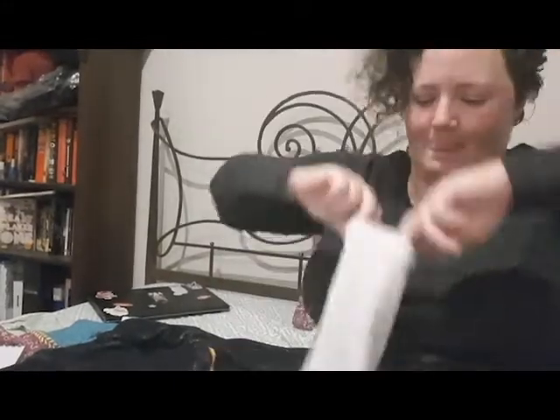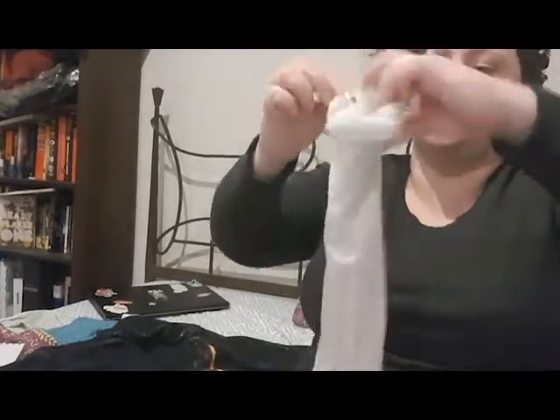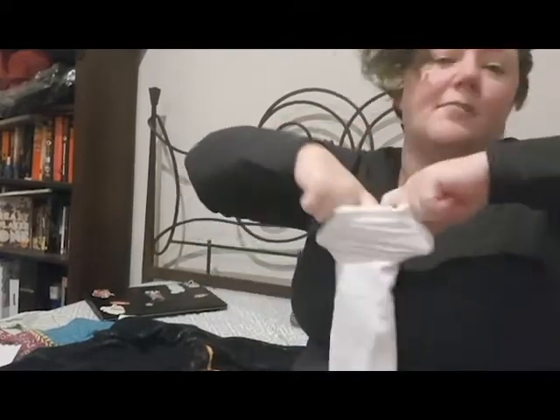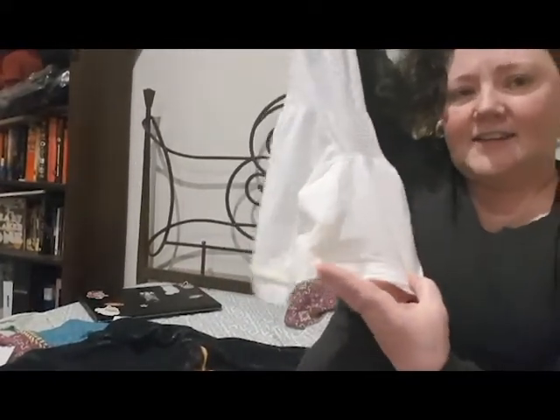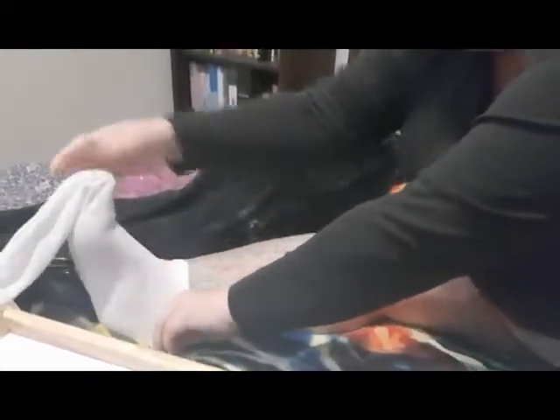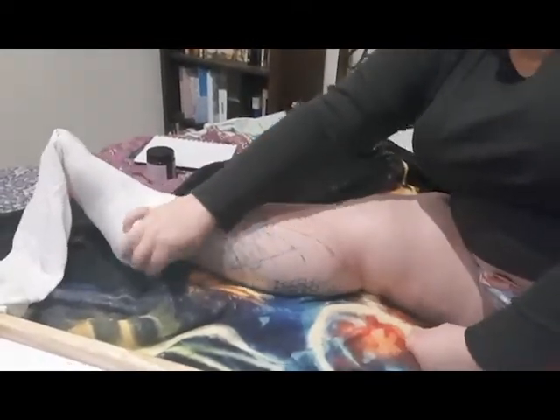Okay, so I can feel for the extra loose lumpy bumpy bit for the ankle, for the heel. So I can see there it suddenly starts wanting to flare out. That means that's the ankle for me. Fold it so that the anti-itchy, anti-irritant bit is going to be on the inside of my leg. I put it on my leg, put it in so that the heel is in place.